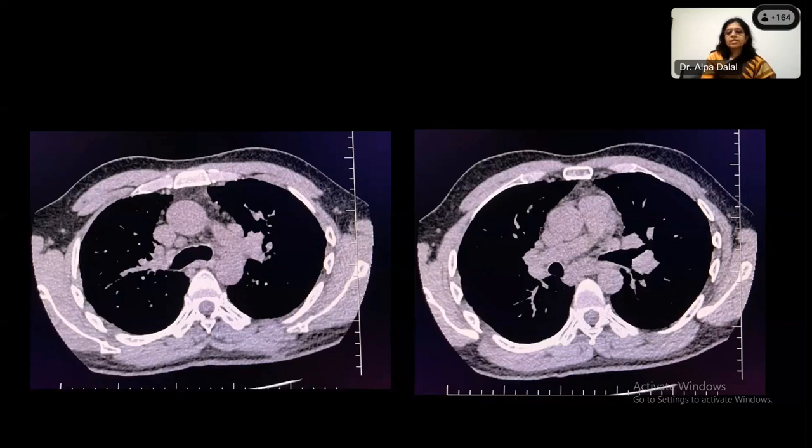We did the bronchoscopy in this patient, and here we combined bronchoscopy with EBUS, which is endobronchial ultrasound, and even the endobronchial mucosa had a typical appearance of sarcoid involvement. So we did biopsy from the endobronchial tissues, transbronchial lung biopsy, and we did EBUS lymph node sampling also, and all three did show us non-necrotizing granuloma. But here I would like to say that even for a pathologist to confidently say that tuberculosis can be ruled out is very difficult. Sometimes in early stages of TB, we get granuloma which may not be necrotizing. So we always have to wait for the culture report to come.